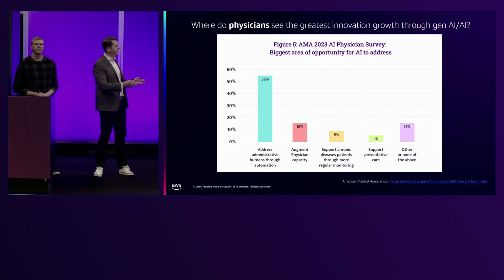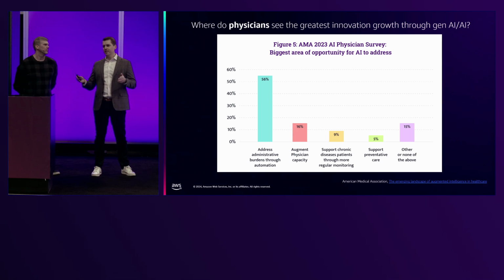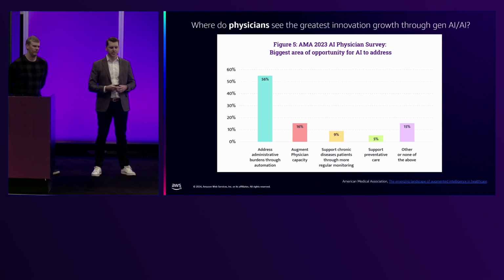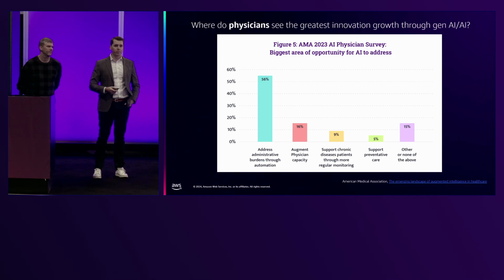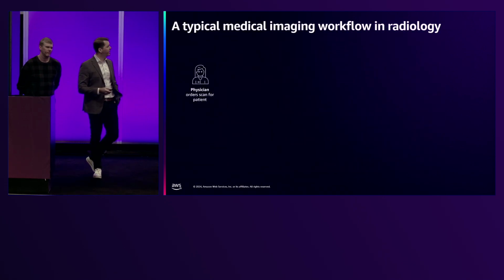If we look at this same information from a radiology lens, a radiologist is going to want to see things like, hey, the right order has been created, or they have the right set of views to do proper analysis for a given patient, given their condition. Even the angles at which you're taking these images is extremely important, and if a radiologist doesn't have the right views, they can't provide the right feedback and the right summaries to downstream specialists and clinicians. And then lastly, they need the right kind of artifacts to draw overall conclusions for patients and ultimately improve patient care in that process. And we'll touch a little bit on that on the next slide.